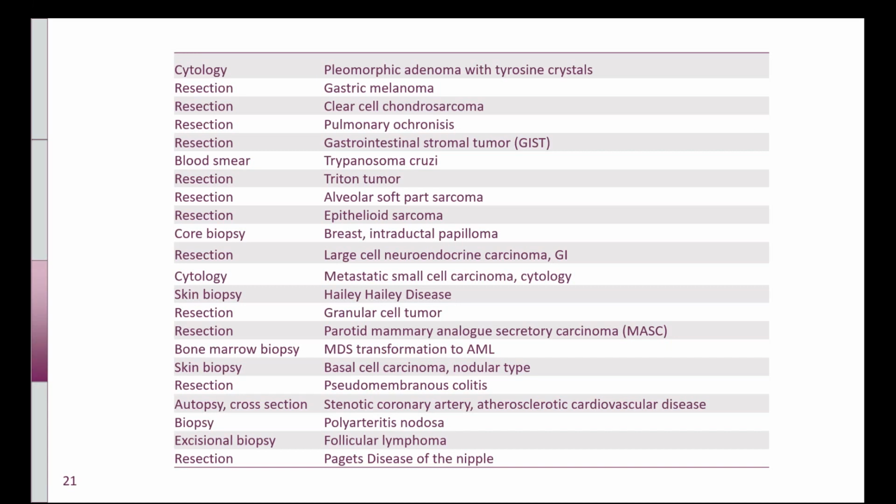Here's a representative list from the cases that were scanned and placed in the UPMC Panoptiq slide repository. Cases included many different subspecialties and, more importantly, were found to have sufficient resolution to display cytology and hematology cases. These two subspecialties in pathology have traditionally had difficulties when it comes to slide scanning, but the unique capabilities of the regional Z-stacking allowed these cases to be captured and easily viewed while maintaining low file sizes. And you can see from this distribution of cases, it included cytology, skin biopsies, and resections, as well as autopsy.